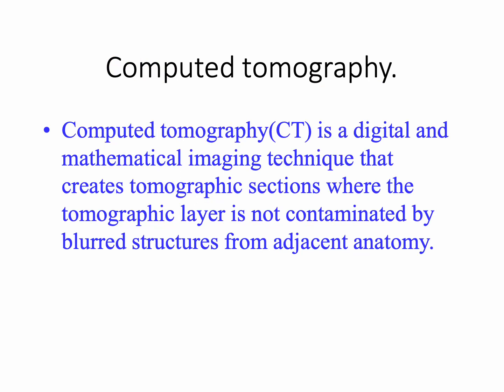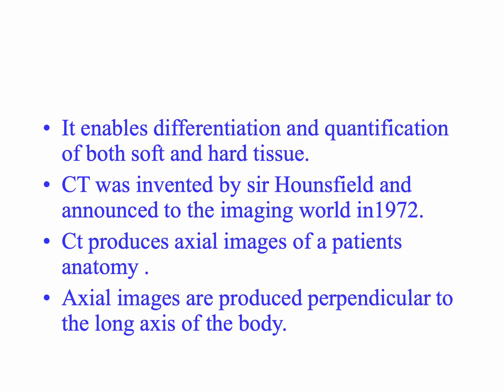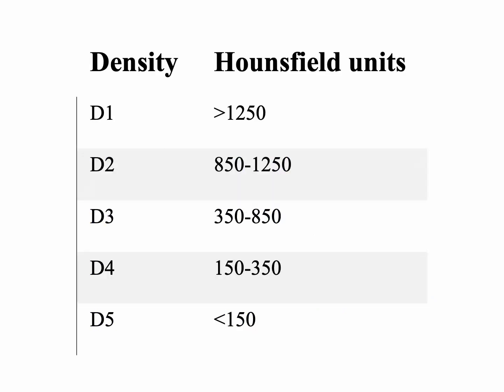CT is computed tomography. It is a digital and mathematical imaging technique that creates tomographic sections where the tomographic layer is not contaminated with blurred structures from adjacent anatomy. It enables differentiation and quantification of both hard and soft tissues. CT, which was invented by Sir Hounsfield, announced this imaging technique as early as the year 1972. It produced images in various axial planes that are perpendicular to the long axis of the body. According to Hounsfield units, these values indicate the mineralization of different types of bone.